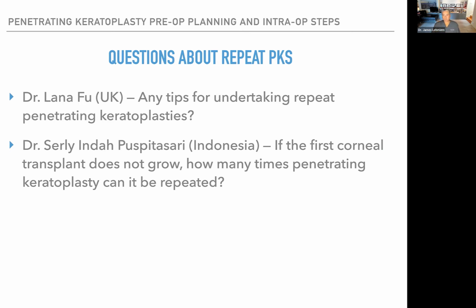I will not try to strip. It's pretty aggressive, especially if the graft has been in there a long time and is scarred in. It's pretty rough on the eye to peel or rip it out. So I like to re-trephine, and I like to center it not on the previous graft, especially if that one were decentered, but rather on the geometric center of the cornea.